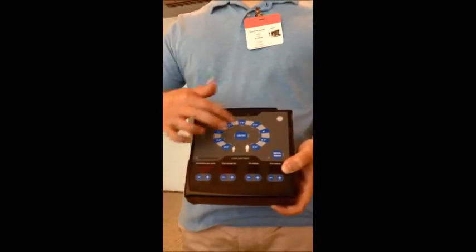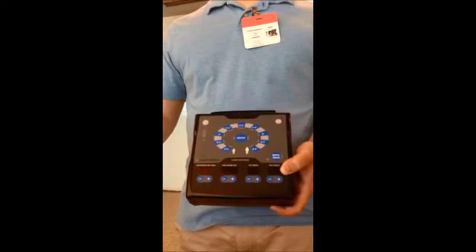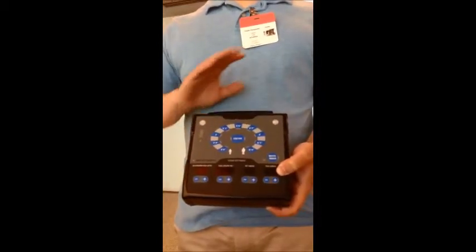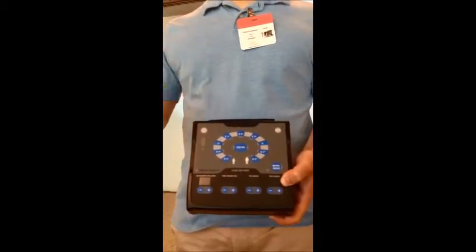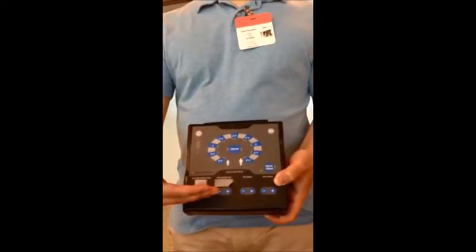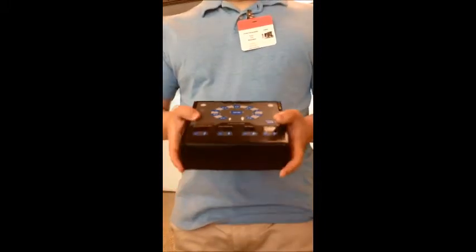So all you have to do is select the patient's height, press confirm, and that will deliver a safe, appropriate tidal volume, respiratory rate, and peak inspiratory pressure limit for that particular patient. So that way you can start ventilating immediately and safely until someone with more expertise and training can come over and override the device and set other settings to change the tidal volume, respiratory rate, peak inspiratory pressure, or PEEP if necessary.